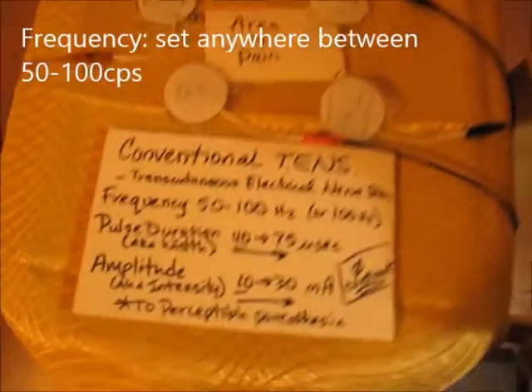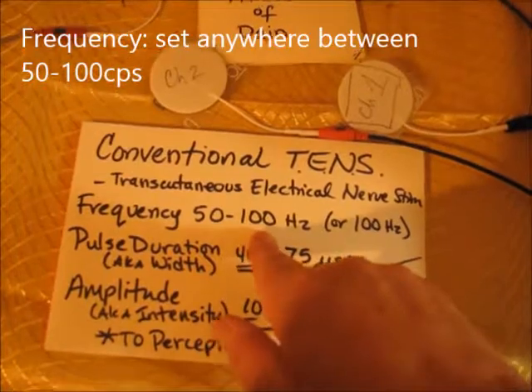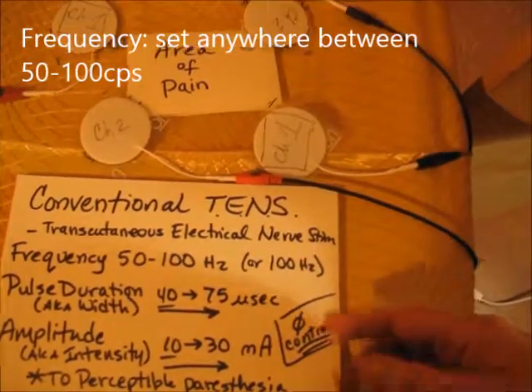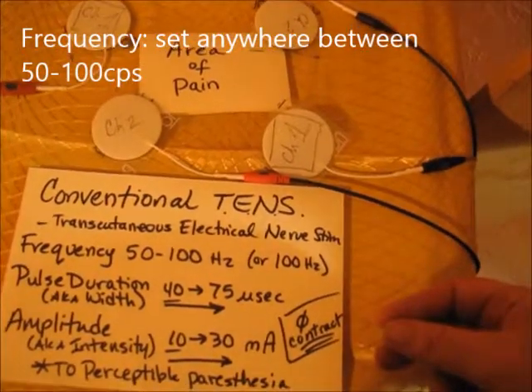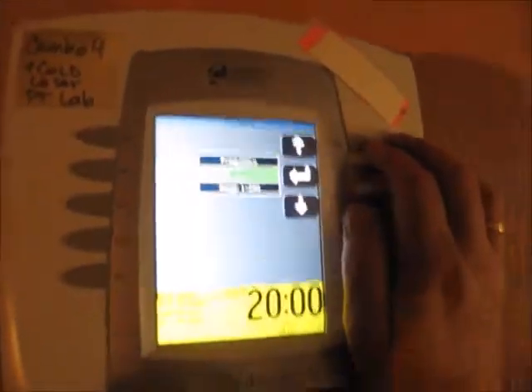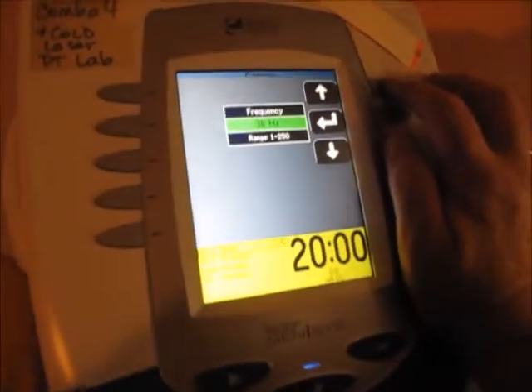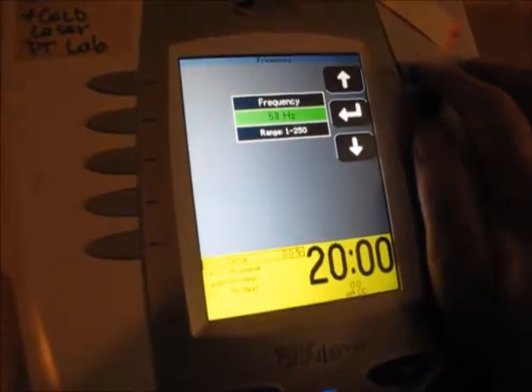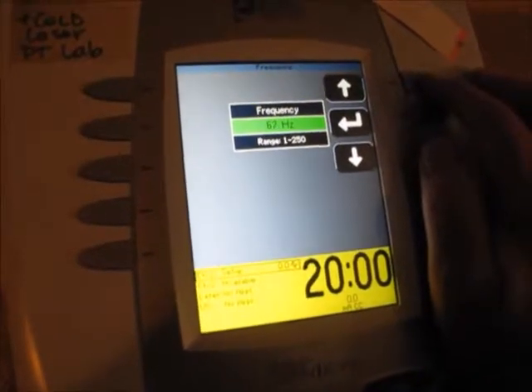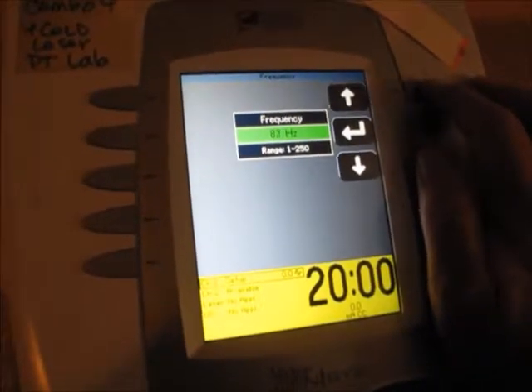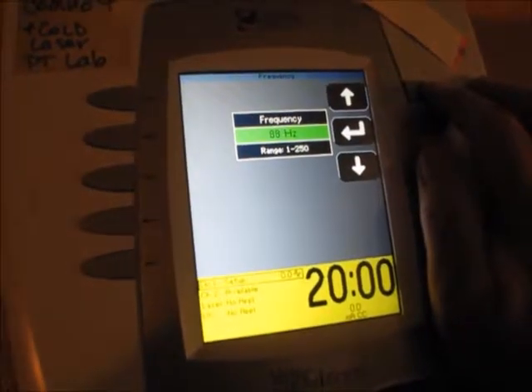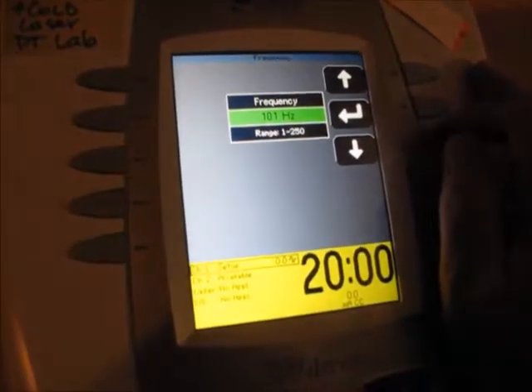Now set up the frequency. Honestly it doesn't matter much — the frequency range is anywhere between 50 and 100 Hz. I like 100, so I am going to use it, because frequency will not change the sensation to the patient nor the therapy. Going all the way up to 100 Hz now — you have to hold the button down so it doesn't beep a thousand times. We are at 100 Hz.